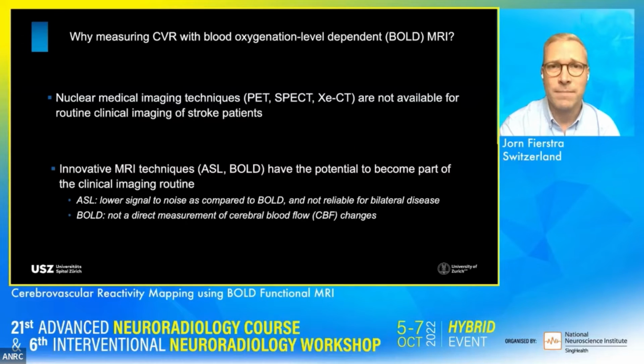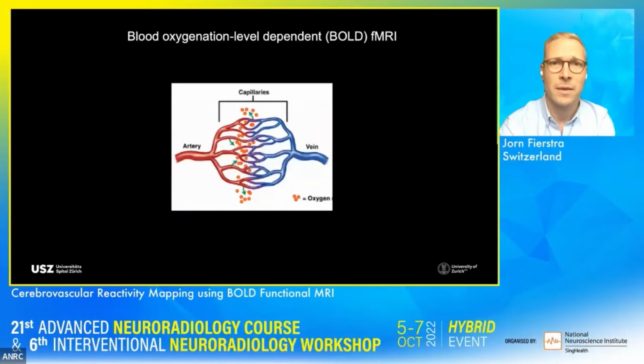For BOLD, we chose it since it has a high imaging spatial resolution, and it could be repeated quite easily. I mean, it's a highly repetitive scan. It is, however, not a direct CBF, cerebral blood flow measurement. This is the major disadvantage of BOLD, so to speak.